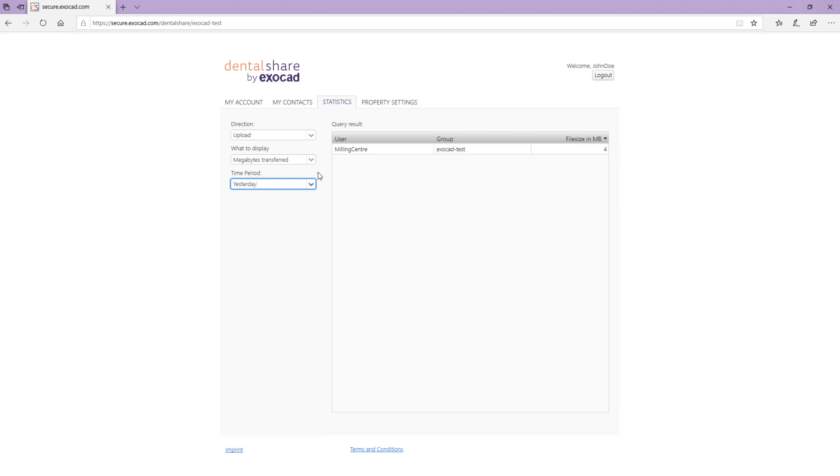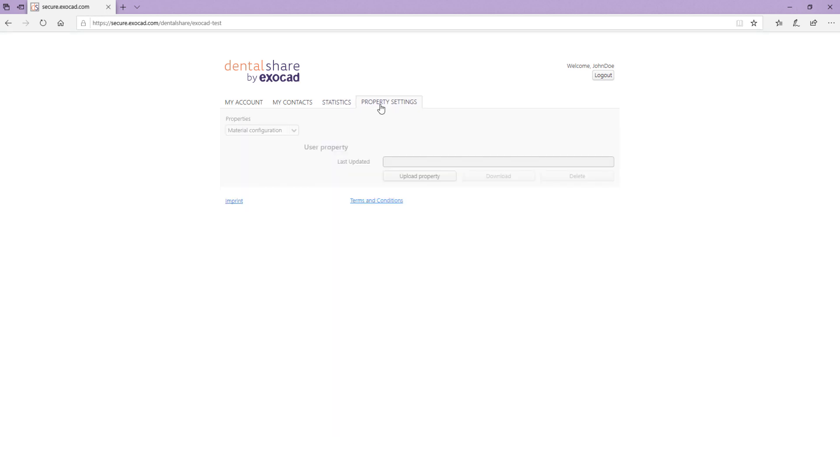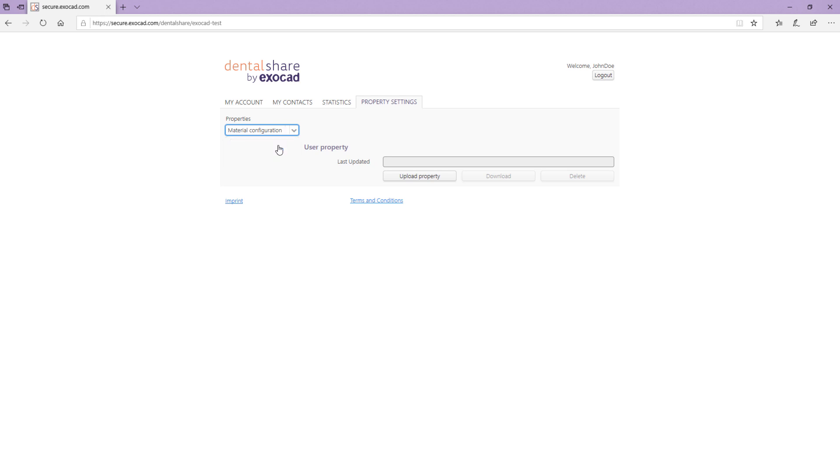In the Property Settings tab, you can upload your own material list to share it with your partners if you offer production services. This allows your partner to create a production service order with your material list that fits your production devices.